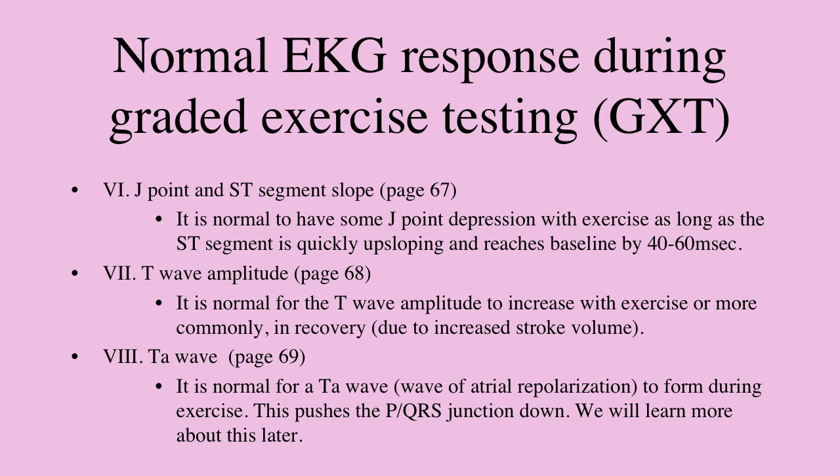But the implications of this are that it pushes the PQRS junction down. In other words, where you start the QRS complex, either with a Q wave or with an R wave, is pushed in a downward direction. And this will have implications later today, not too long from now, when we start to read the ST segment depression, the amount of ST segment depression.